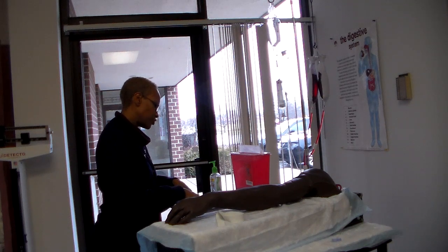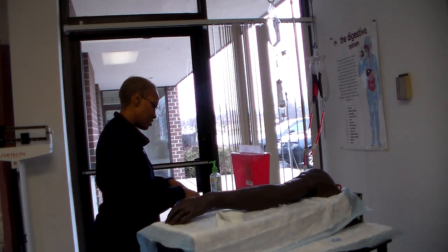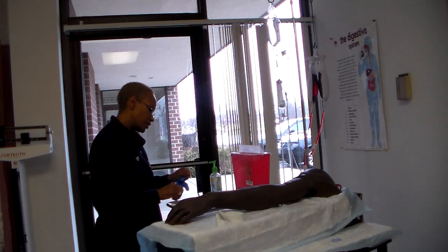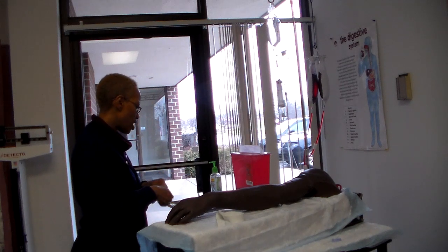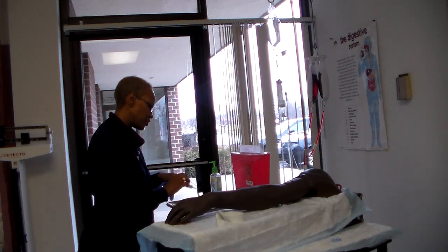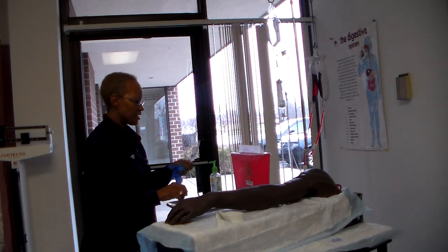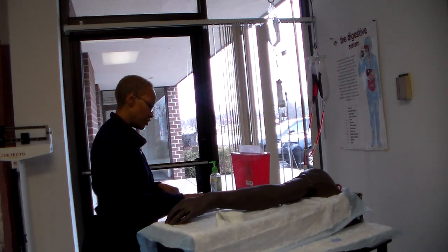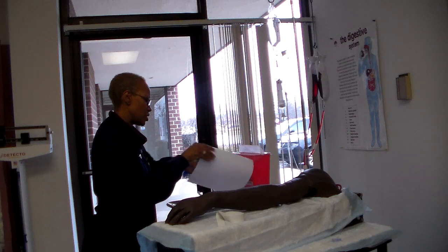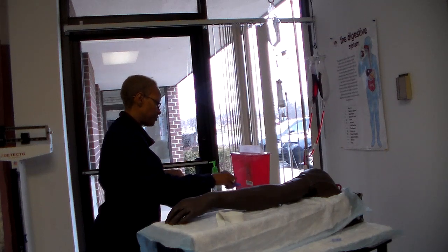Basically it's saying to make sure that you maintain aseptic technique by not touching the spike or the end of your tubing. Already talked about priming your tubing, turning it on and off, making sure there's no air in it. And then we're going to have a lock infusion for us to flush with, syringe for us to flush with.